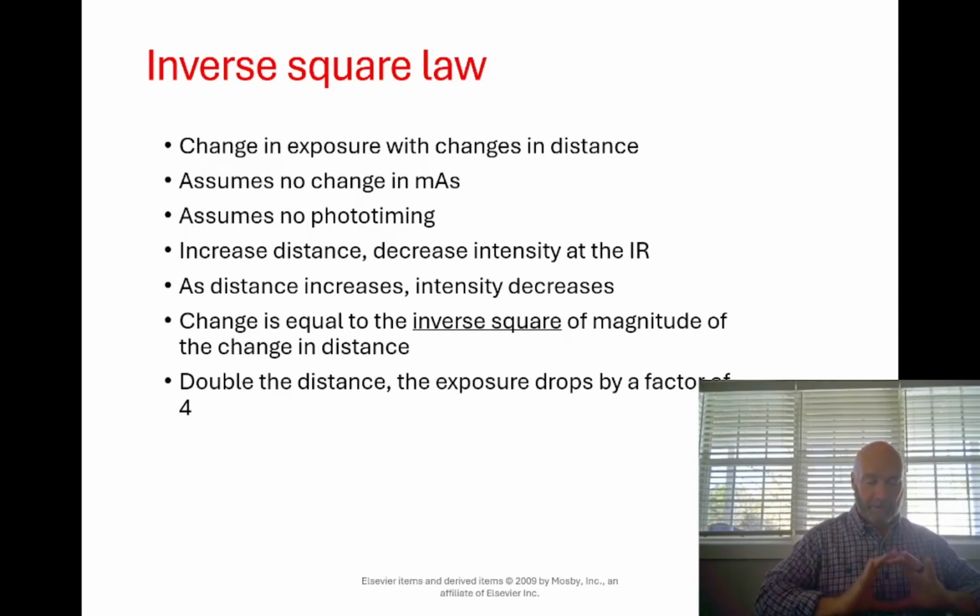But if I just make an exposure this big, and that's all I'm interested in seeing, if I back up to 80 inches, then what's going to happen is that's going to change, and it's going to double in 2 different dimensions. So I'm going to have that much here, that much here, that much here, and that much here. So it's spread out over an area 4 times as large with the same exposure.